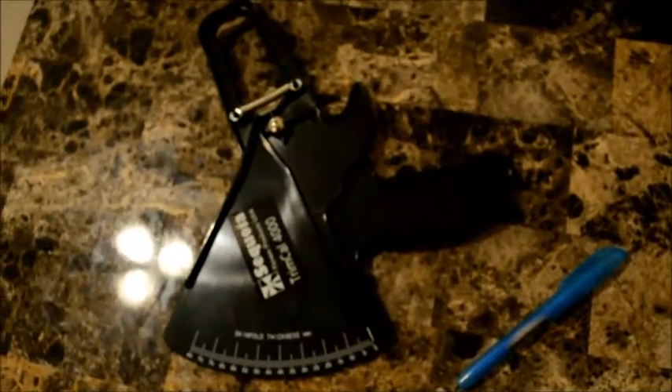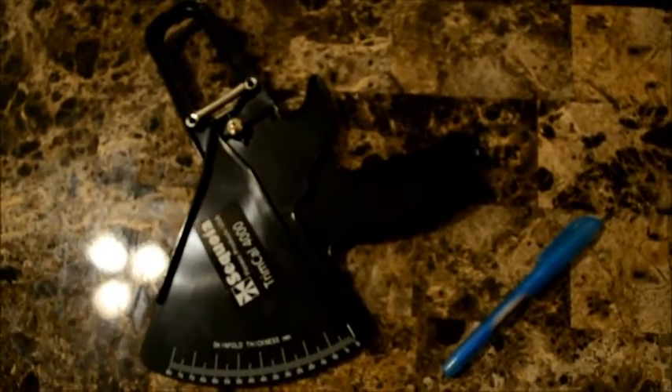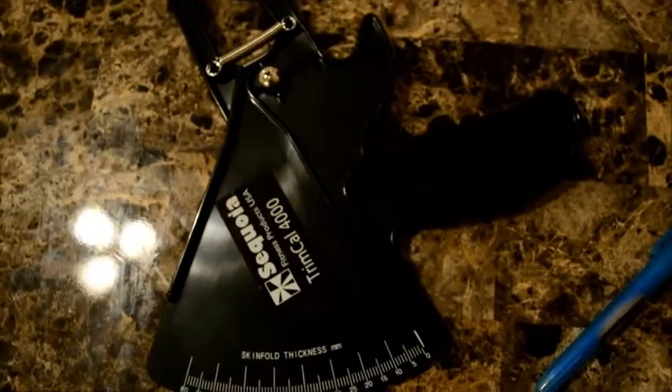This video demonstrates how to take a 7-site skinfold measurement. For equipment, you will need a skinfold caliper and a marker.